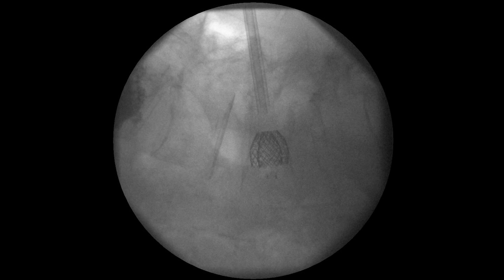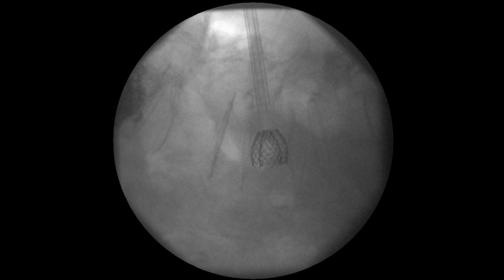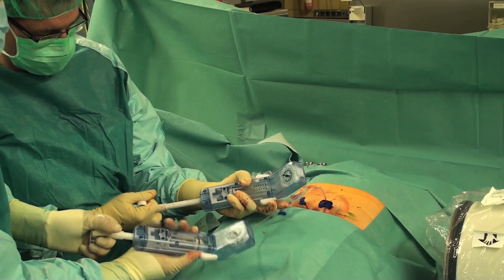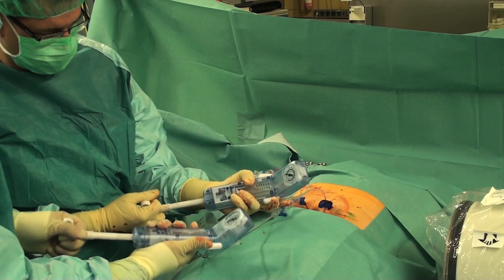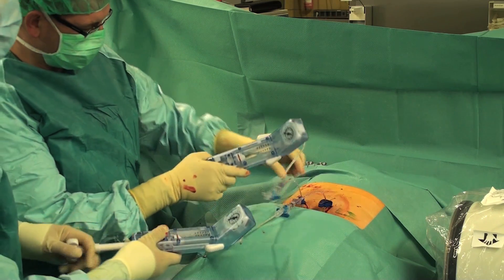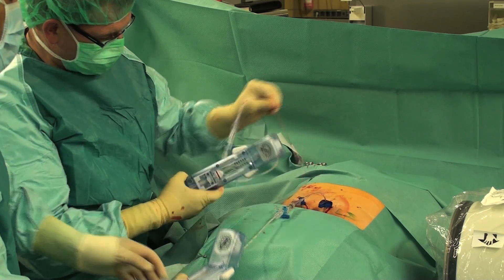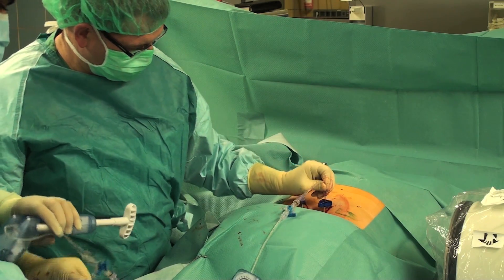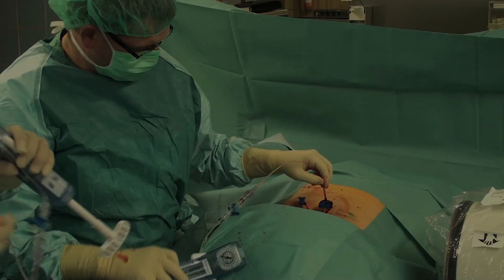As soon as the vertebral body stents have reached their optimal expansion ratio, the balloon catheters are deflated and removed from the reconstructed vertebra. The stents remain in situ. As the vertebral body stents are not designed to be stand-alone implants, they need to be filled with PMMA bone cement.